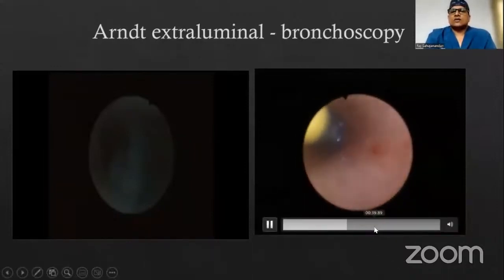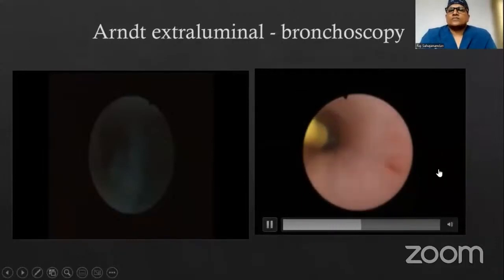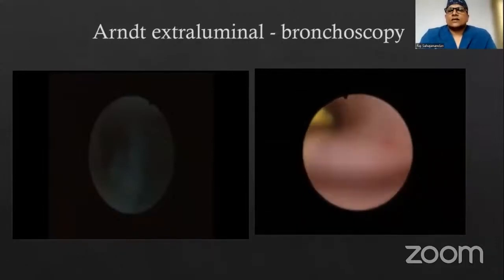I would like this part. I am not. Okay, I'll just probably wait for. It's only a minute. I'll wait. So trying to do this on the left side is easy because you have a margin of safety. But on the right side it can be a bit tricky.